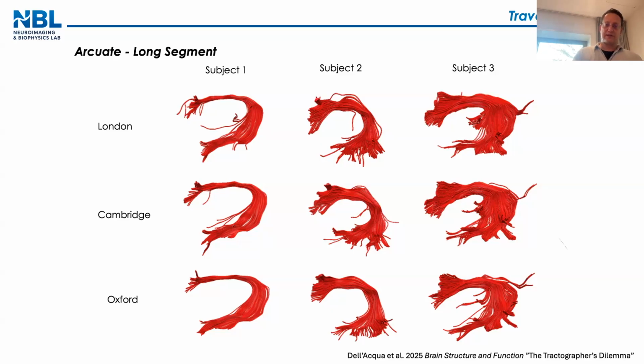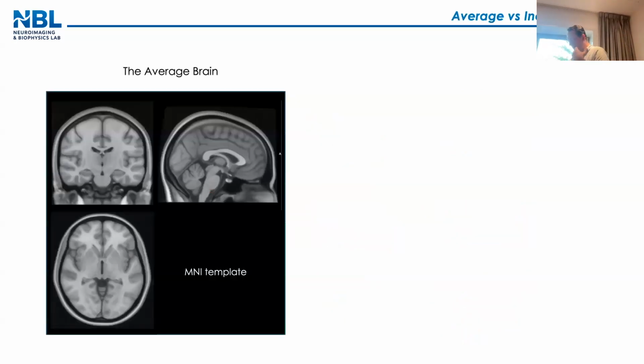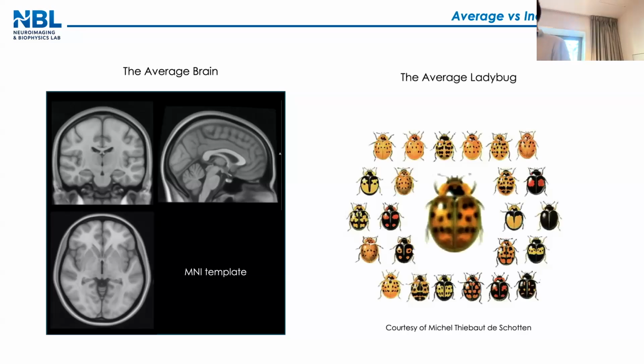And again, this is important because, for example, I think I'm showing a slide now that probably many of you are already familiar with. Most of neuroimaging is living in MNI space. We normalize structural, we normalize fMRI activation because we think, and I'm not saying it's wrong, okay? I'm not making any criticism. I'm just saying we do that because it's easy to work with. But, and I'm sorry that Michel is not here because I stole one of his slides.